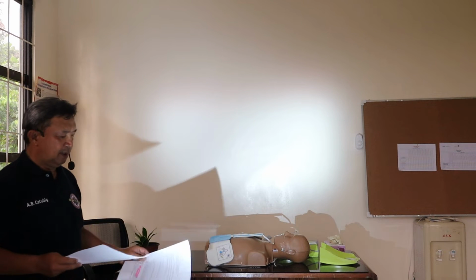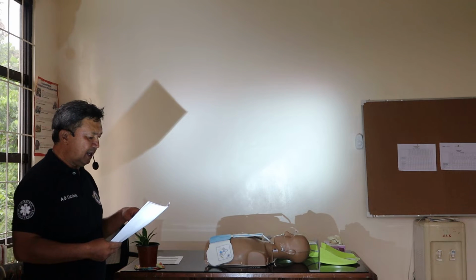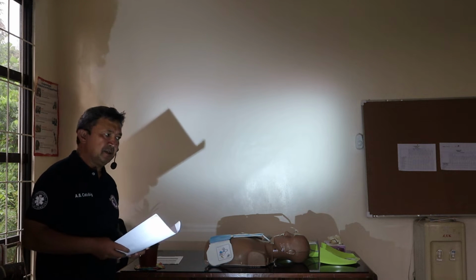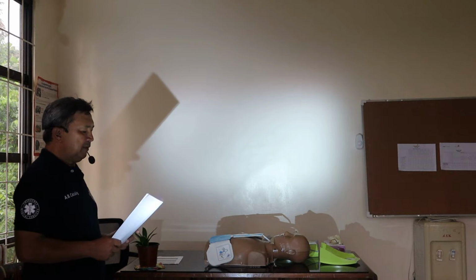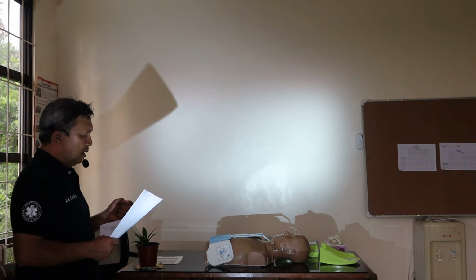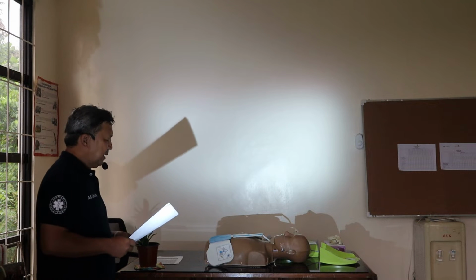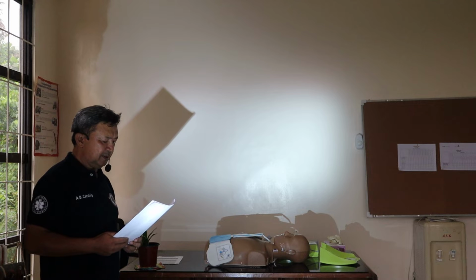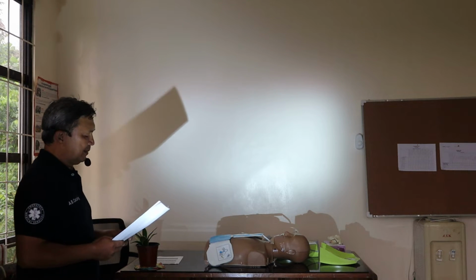Before you go, I will give you two questions. The first question is, when do you administer or apply the AED? Okay, that's very good. Good answer. The second question is, where should the AED be placed?